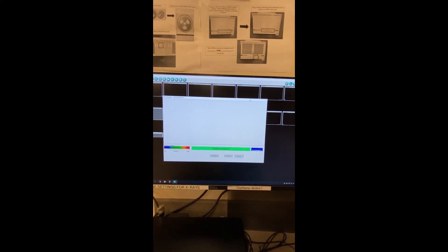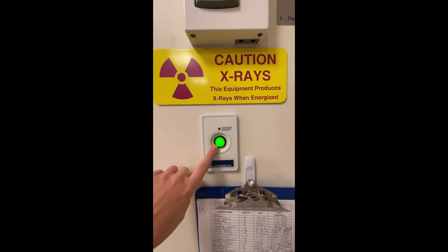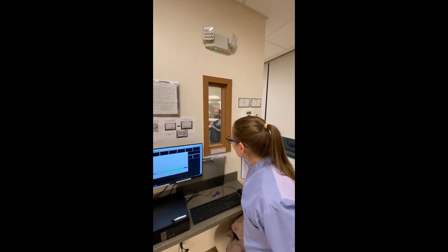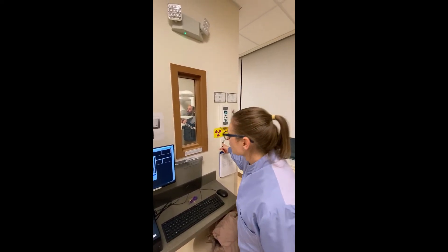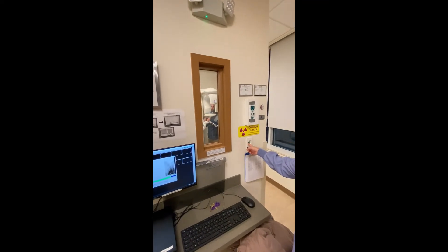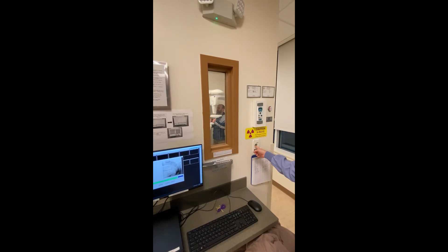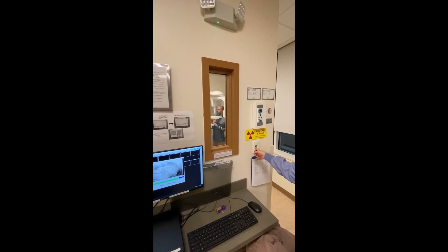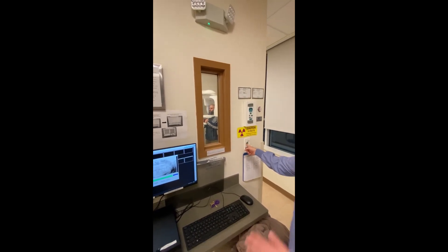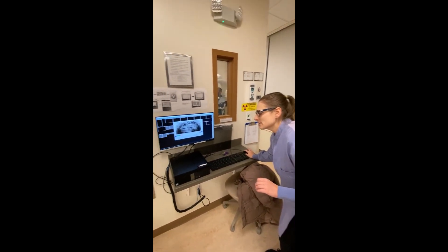When your computer goes from waiting to ready to waiting for exposure, you're ready to expose the panorex. At this point the button will be solid green. Press and hold the button for the entire length of the exposure, periodically checking on your patient. After the exposure and after the beeping stops, release the button and press okay.